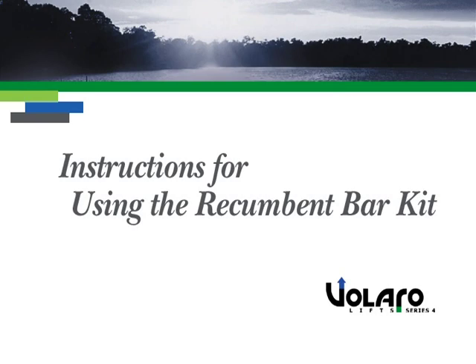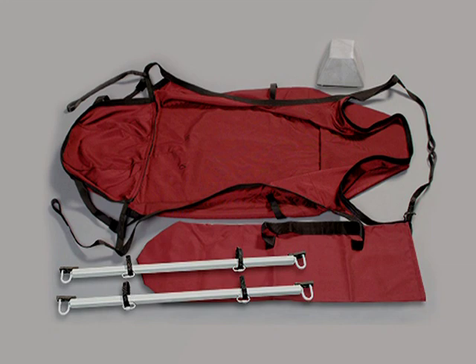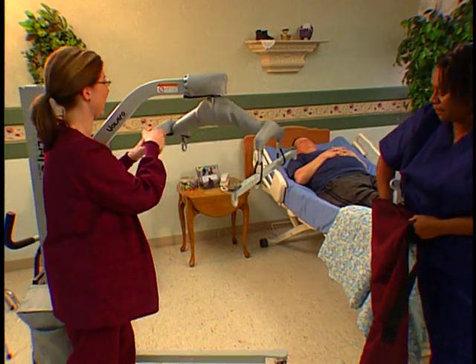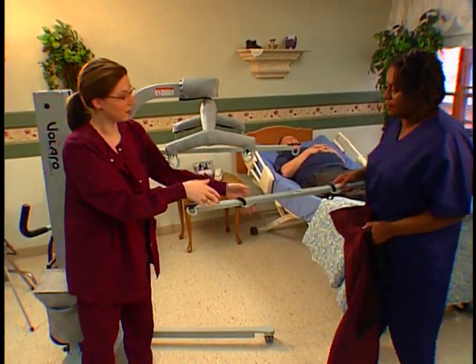Instructions for using the recumbent bar kit. After completing your safety and sizing checks, here are the steps to use the R-bar system. First, assess the patient's medical situation by consulting with the patient's nurse. To prep the lift, first remove the R-bars from the carrying bag. Observe the black nylon loops. If they are frayed, do not continue with the lift.